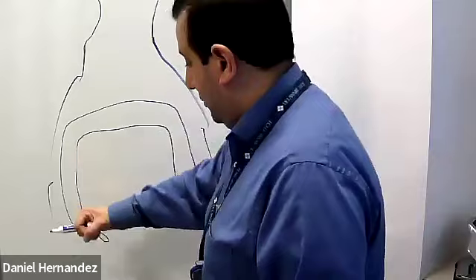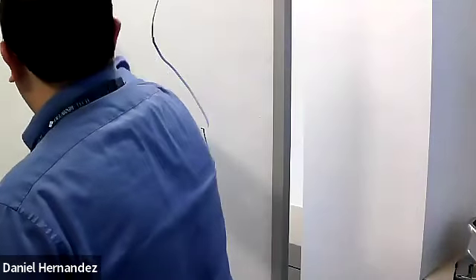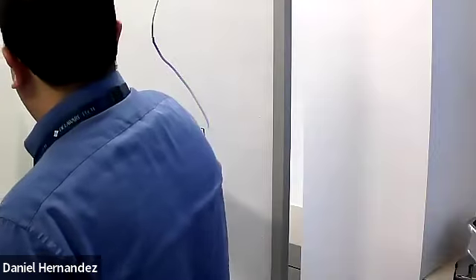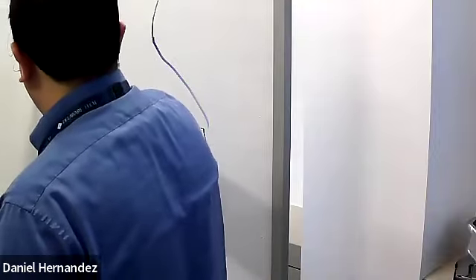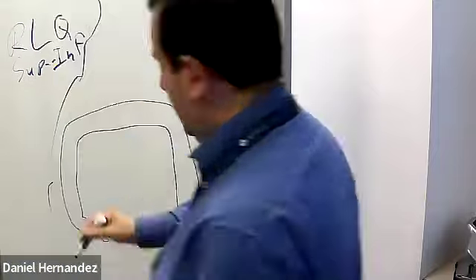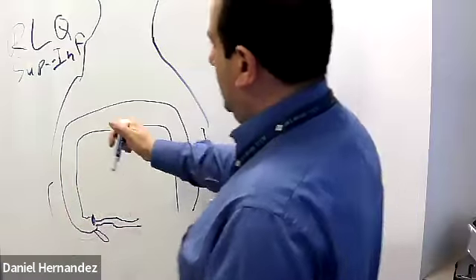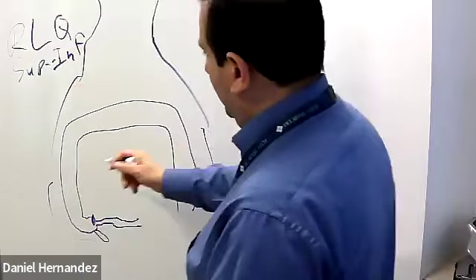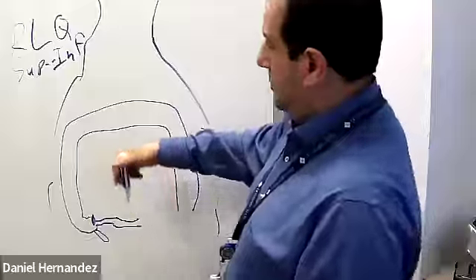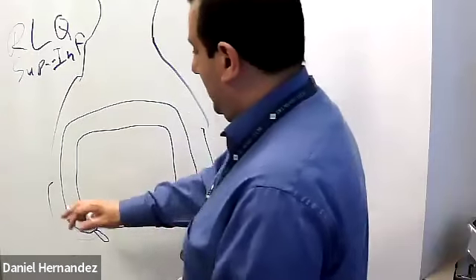We do a transverse sweep and label it right lower quadrant, superior to inferior. Then we do a right lower quadrant sagittal sweep, lateral to medial. So we do a transverse sweep and a sagittal sweep, lateral to medial, in the right lower quadrant.